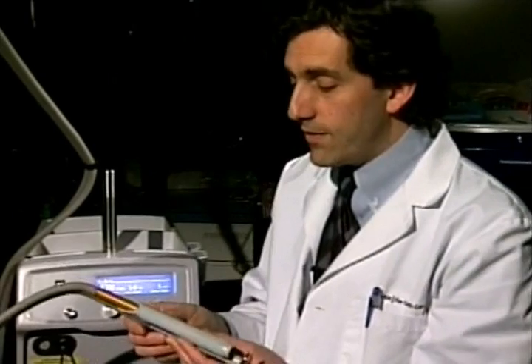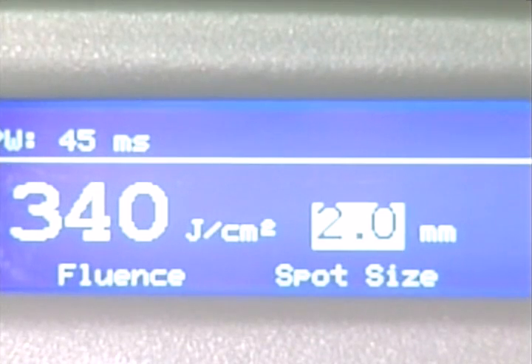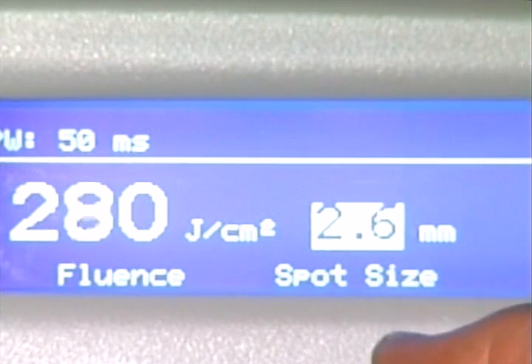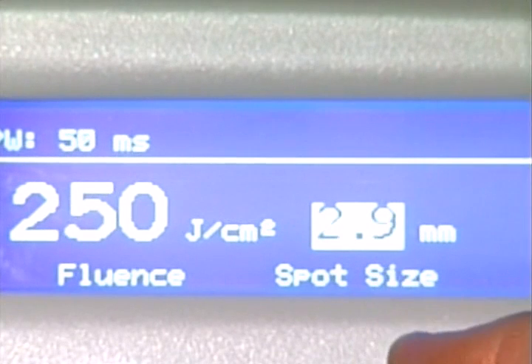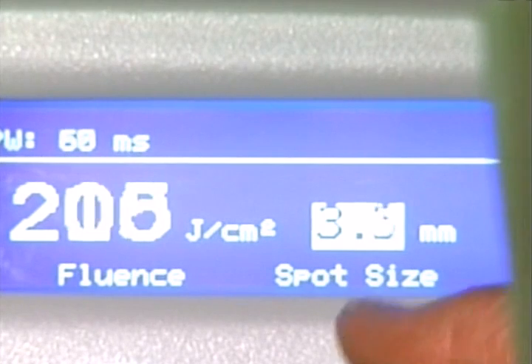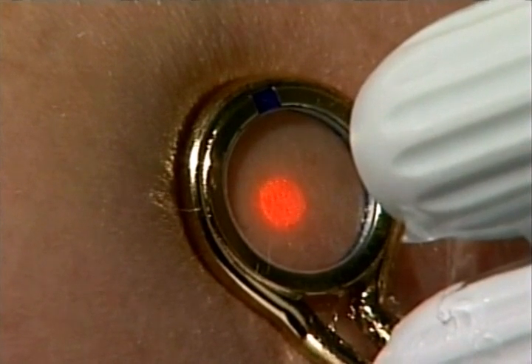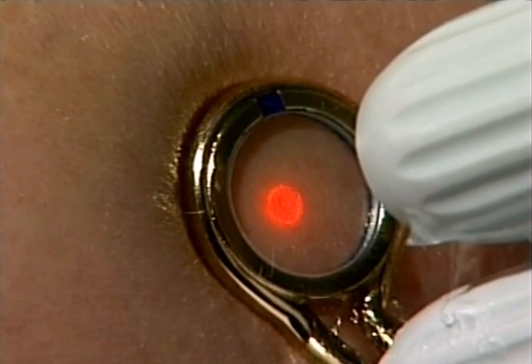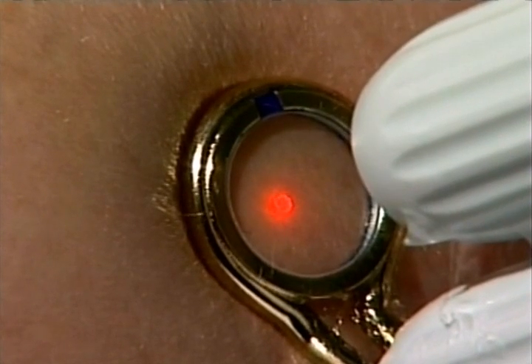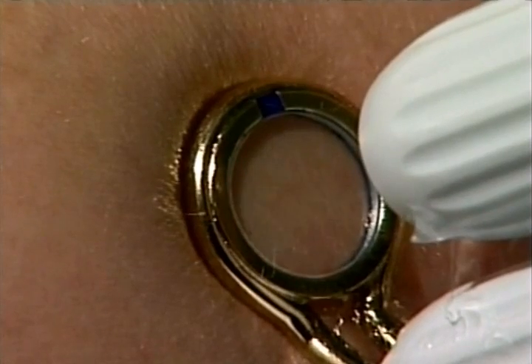The thing that's very exciting about it is you can basically change the spot size just with the dial on the device, and it changes at 0.1 millimeter increments from 1 millimeter all the way up to 5 millimeters in diameter. And while it does this, the laser basically compensates by adjusting for fluence and pulse width while you're changing the spot size. It does this automatically. And then it recalibrates itself immediately before allowing us to treat again. So it's a very easy device to use.